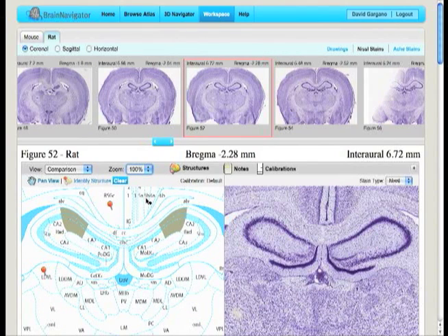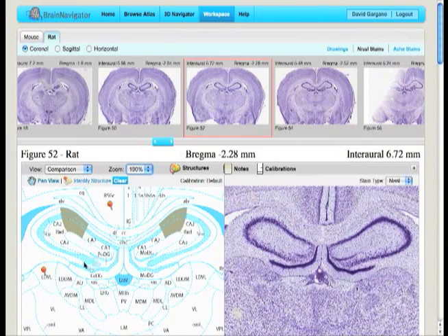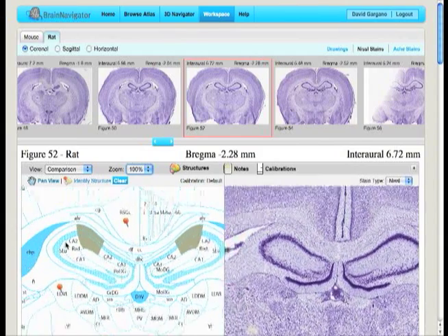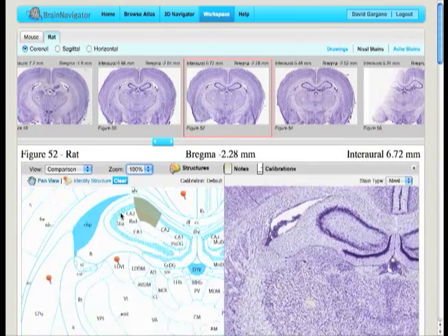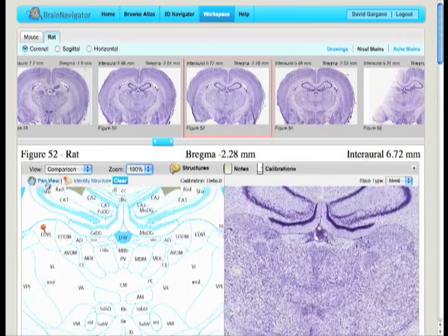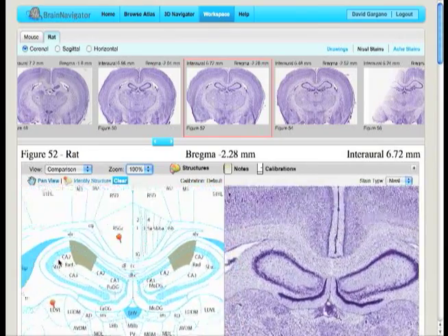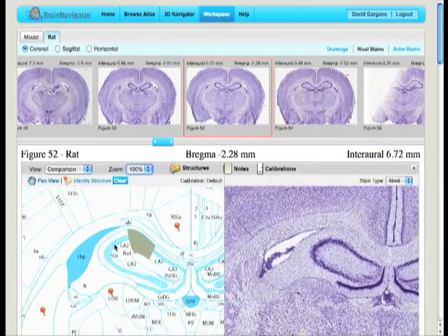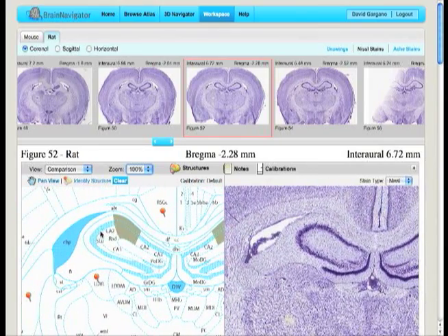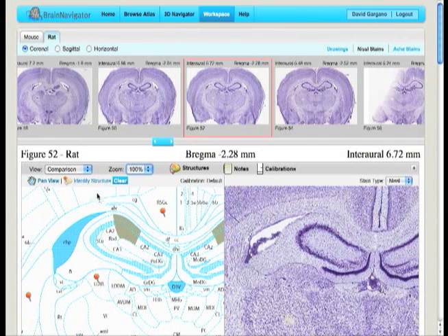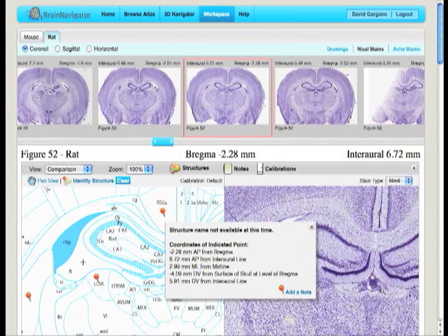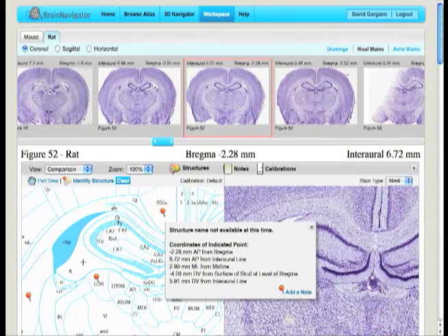You can also use your own images and compare the library of images within Brain Navigator to your own. Zooming into images is easy and allows you to see the stains on a cellular level. And you can reposition to view with the stain and the drawing in sync, so you can keep your position clear and understand the relation of the schematic drawing to the stain.